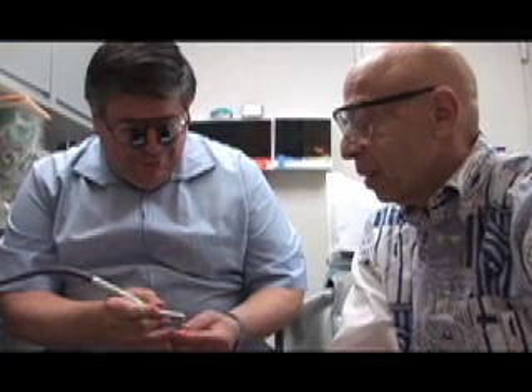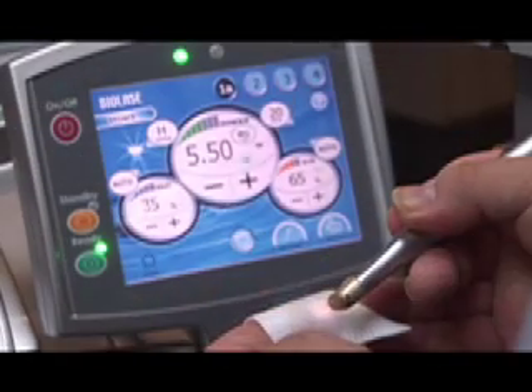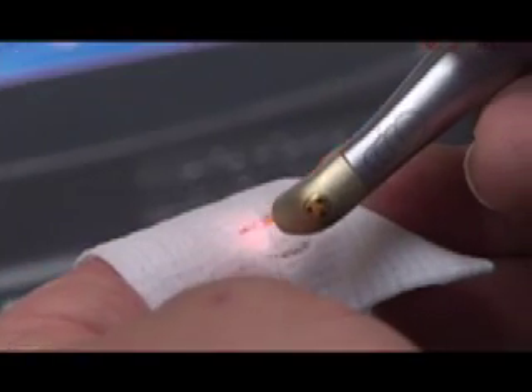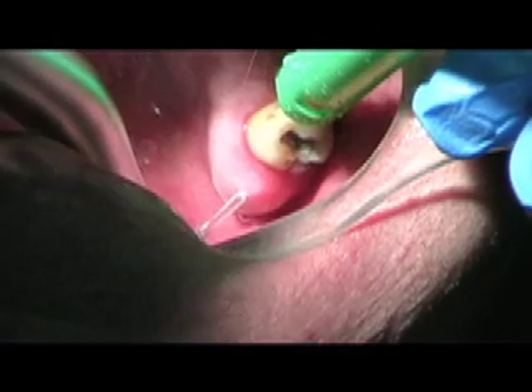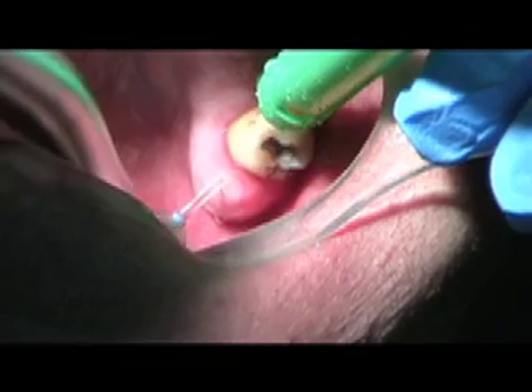We've had lasers in dentistry for more than 10 years. Three and a half years ago we first brought in the soft tissue laser, and with success with that, we've recently introduced the BioLase WaterLase MD state-of-the-art, which came out two years ago but has been an upgrade of the original.